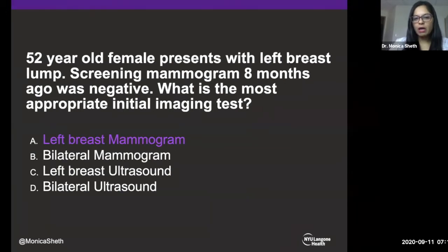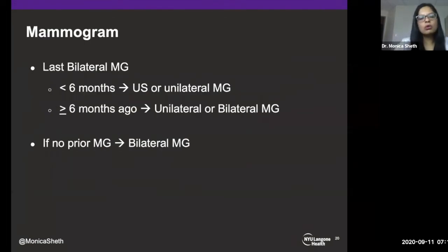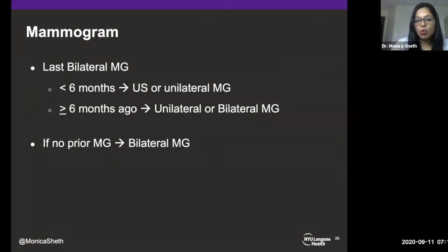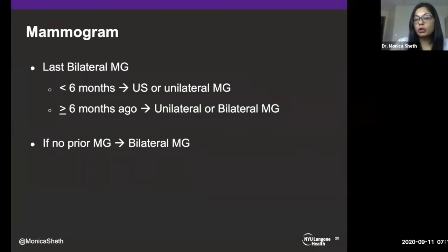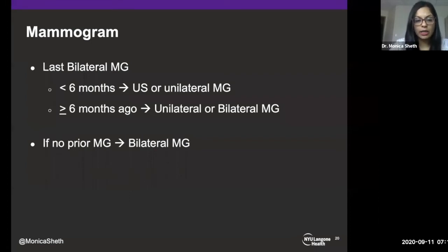If somebody has not had a mammogram before, even if they are 52, you are going to want to start with a bilateral mammogram. Let's also go over mammogram technique. When somebody comes in with a palpable finding, you need to place a dermal palpable marker — in this case a triangular palpable marker, which is the most common. Some places use a round circular BB. Go ahead and do your standard CC and MLO views. If you have tomosynthesis, use it. If not, you may need spot compression or spot magnification views.